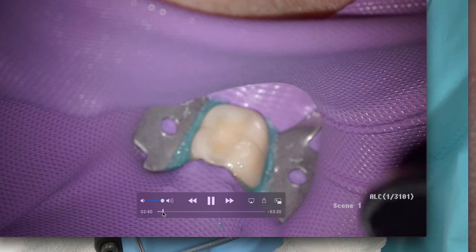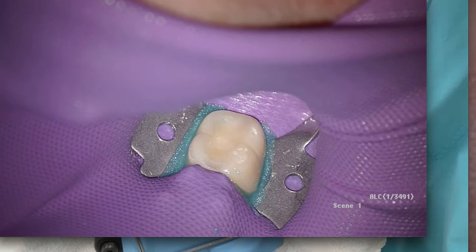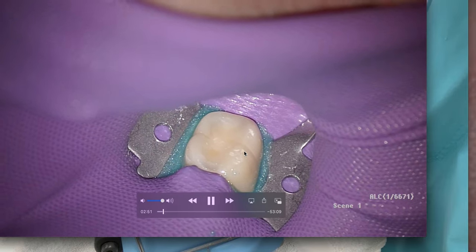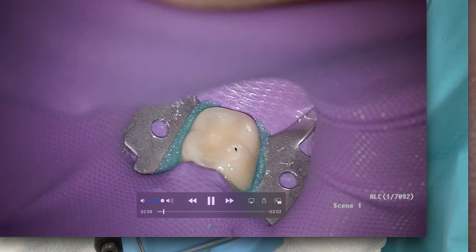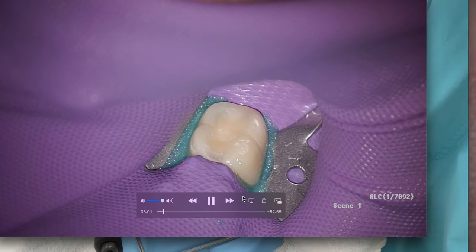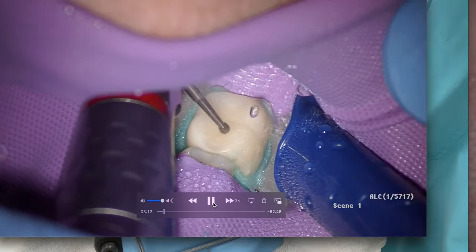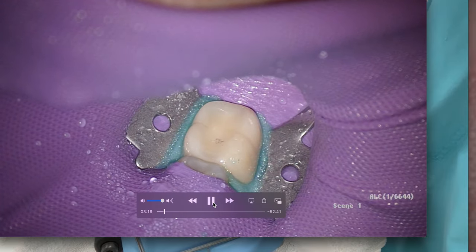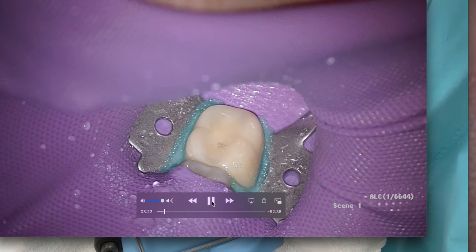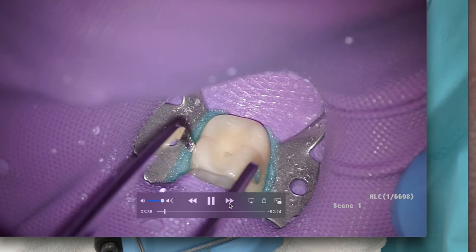My friend Dana sent me this case. The patient had a beautiful temporary crown, and we were doing the root canal after the tooth remained symptomatic — they waited a month to see if it calmed down, and it wouldn't. When I went to access it I thought, 'this is not plastic.' There were no burr marks — it was zirconia. I realized it was a zirconia crown cemented down with temp cement. Yes, that is an error — I'm sorry, I'm human. We took the crown off.